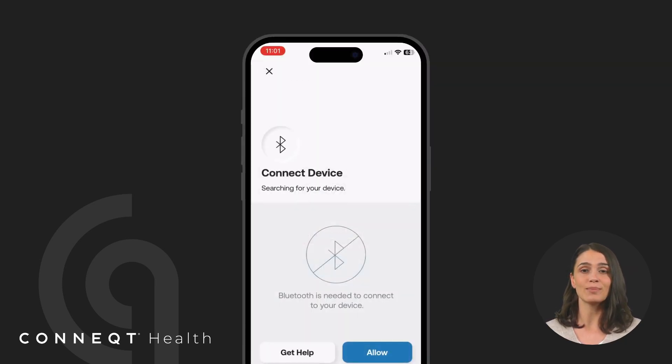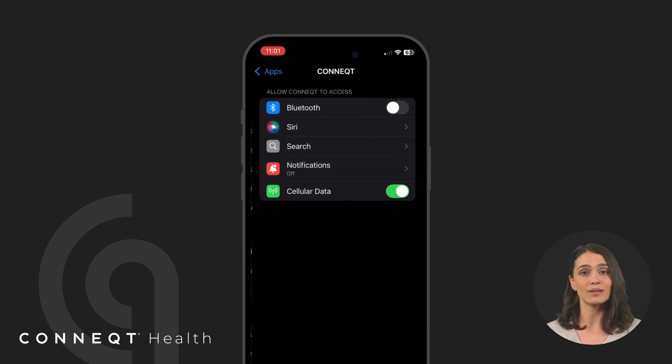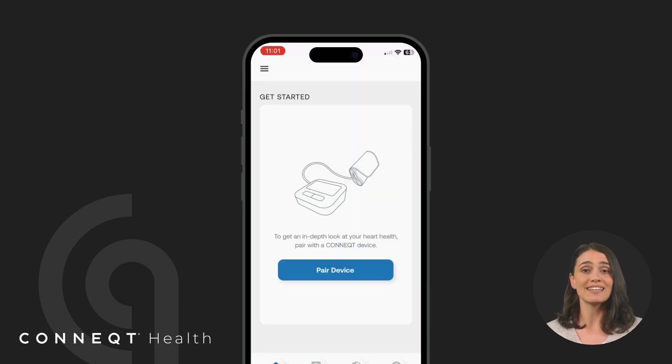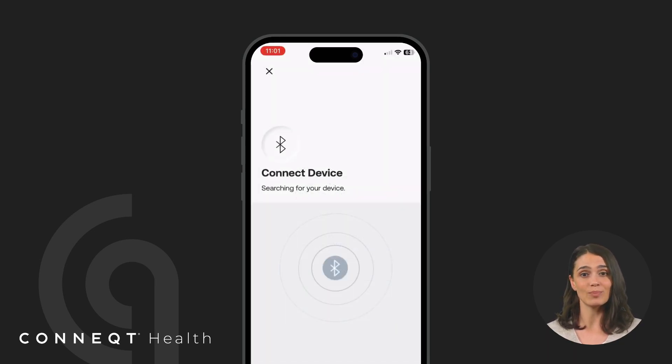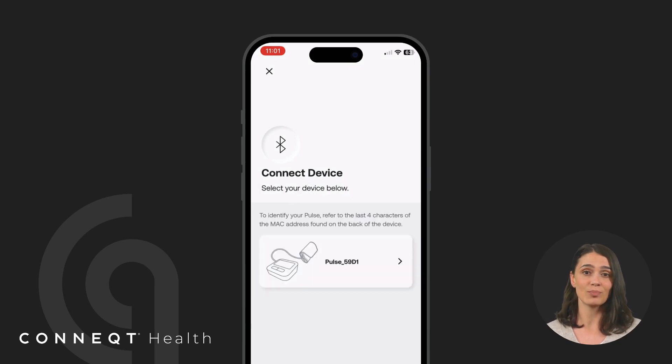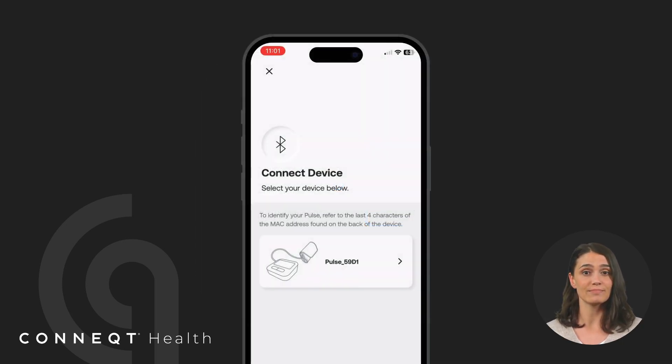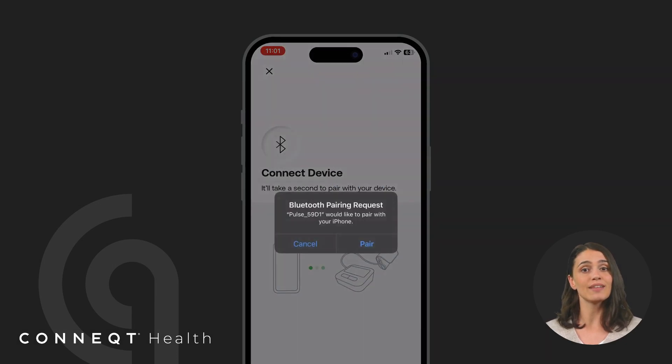Once your Pulse is charged, it's time to pair it with the Connect app. Turn on Bluetooth on your phone and make sure the app has permission to access it. Keep your phone close to the Pulse during the pairing process. When the app finds nearby devices, you can identify which one is yours by referencing the last four characters of its MAC address located on the back of the device. Select your device to complete the pairing process.